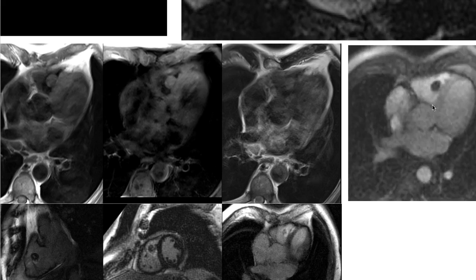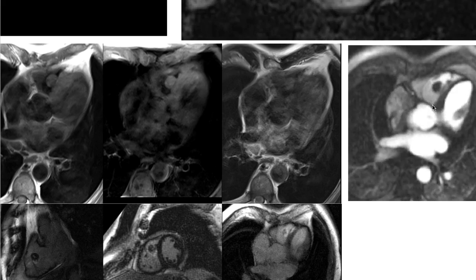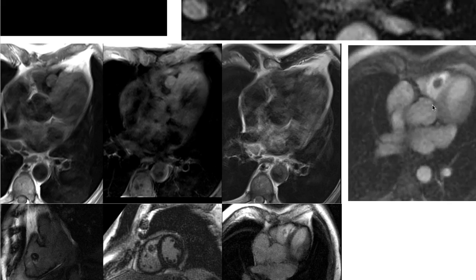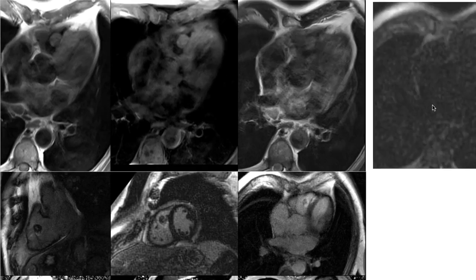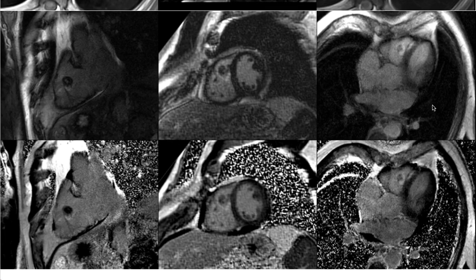Here's our first pass perfusion. Maybe at the very tail end, we start to see a little bit of white speckles show up towards the center of the mass, and that would be consistent with a myxoma. So late perfusion. On delayed enhancement, we see some heterogeneous delayed enhancement of the mass.